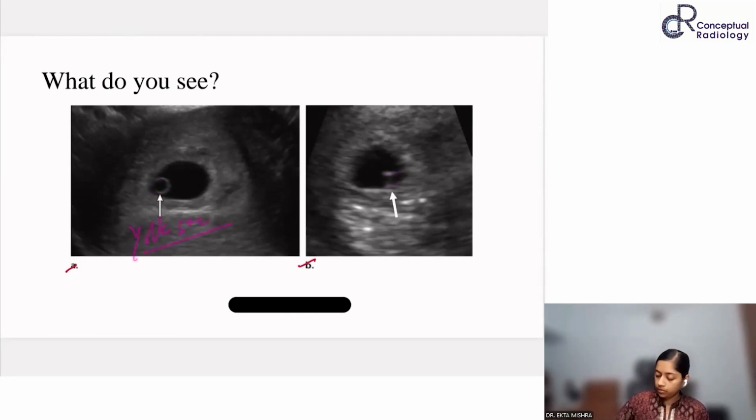And the second one, I'm seeing two parallel lines. What is this? Now we are dealing with early pregnancy only. So everybody is UPT positive in today's images. So what is this? Two parallel echogenic lines within the G sac.